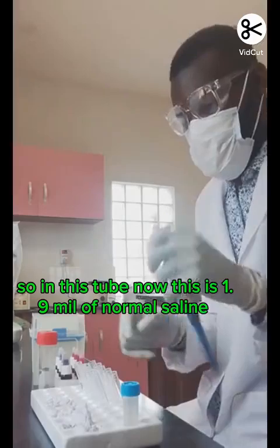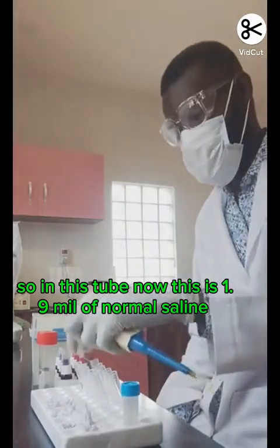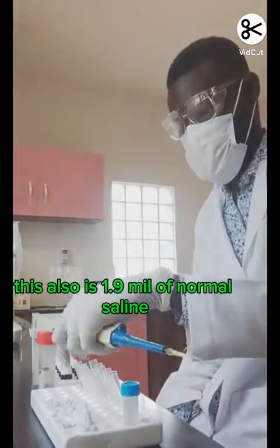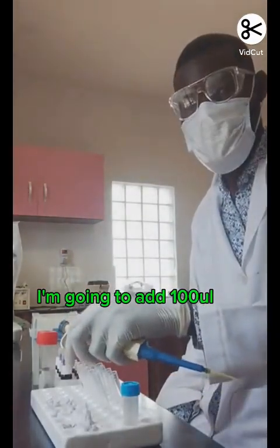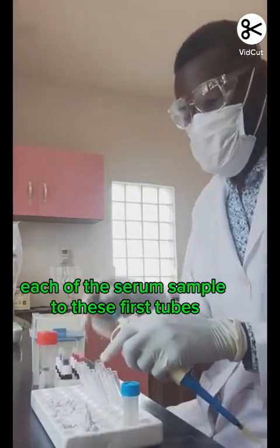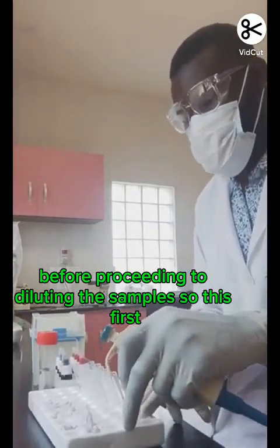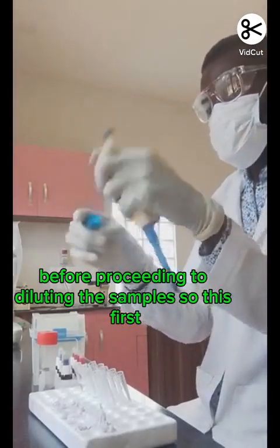So in this tube now, this is 1.9 ml of normal saline. This also is 1.9 ml of normal saline. I'm going to add 100 microliter each of the serum sample to these first tubes before proceeding to diluting the samples.